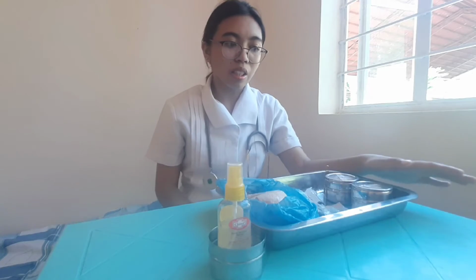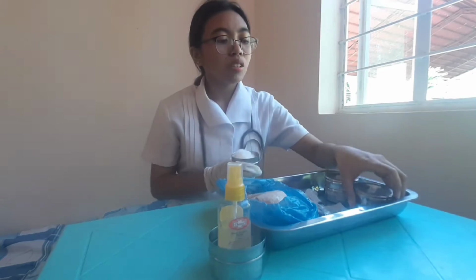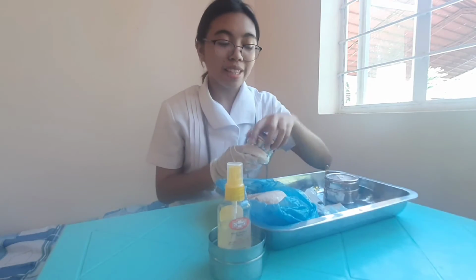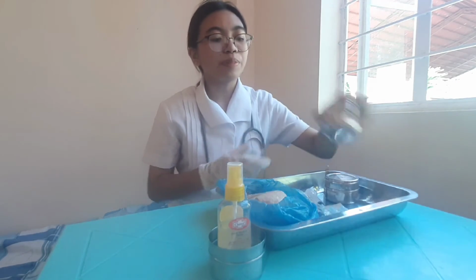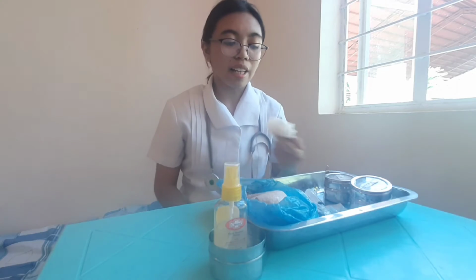Next we have some gauze. But for this video, I have no gauze because there is none here, so I'm going to use some cotton to clean the ampules. And also the sanitizer for us, and then the pair of clean gloves.